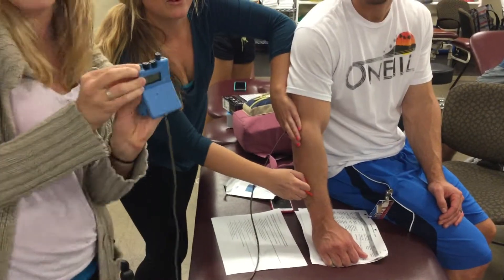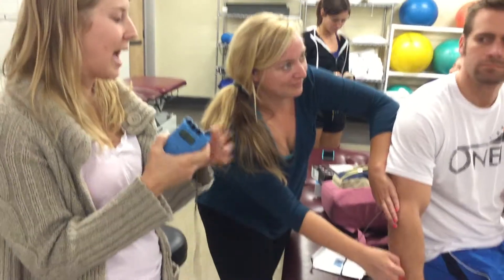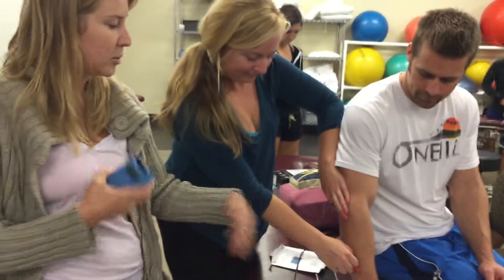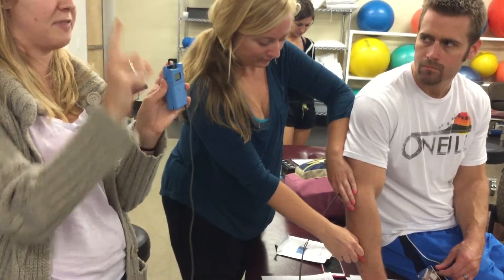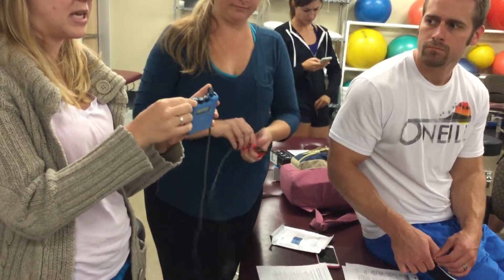If you hear beeping, it means you're not properly connected. If the pads are on the patient and you hear beeping, double-check that the electrode is connected properly and sealed down to the skin. A little finger on the screen will point to the channel where the problem is, and you can reset it by setting it back to P to pause the program.